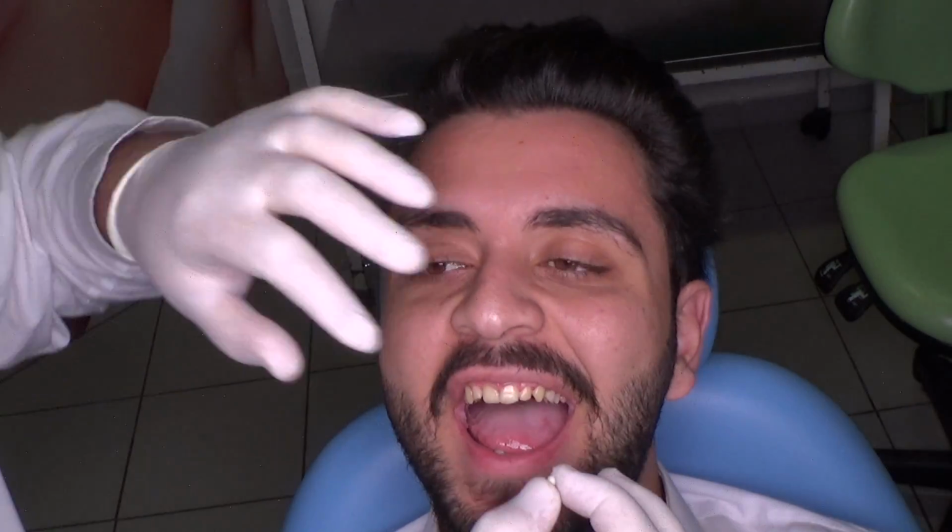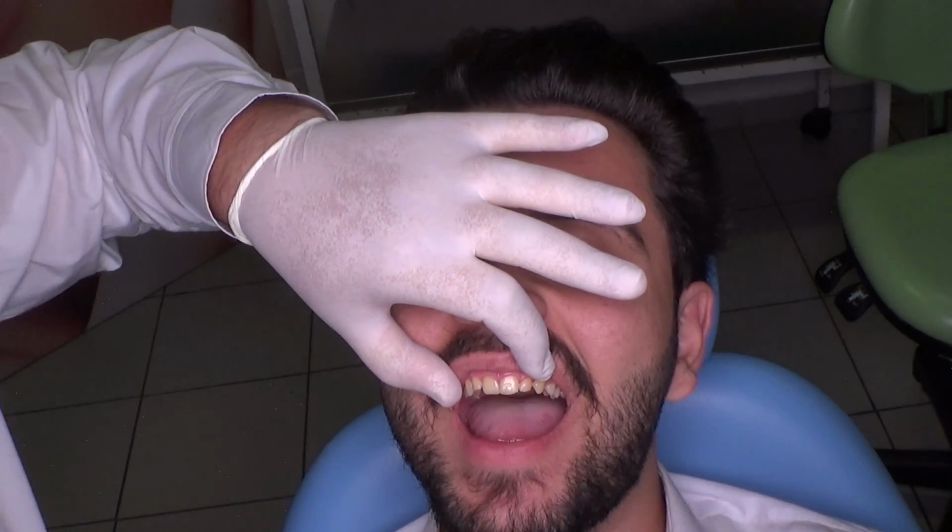Just take a small quantity. You can work with your fingers, nothing special. Like this. And you place, air dry slightly.